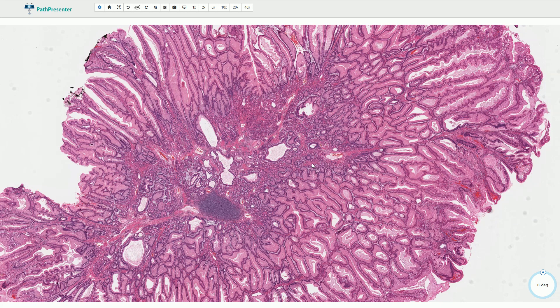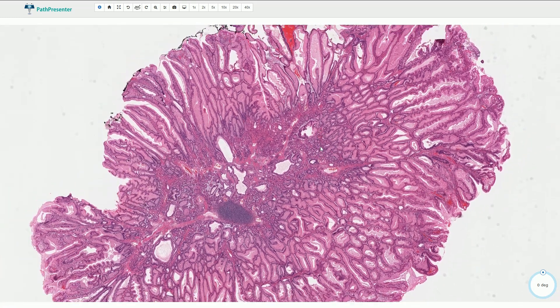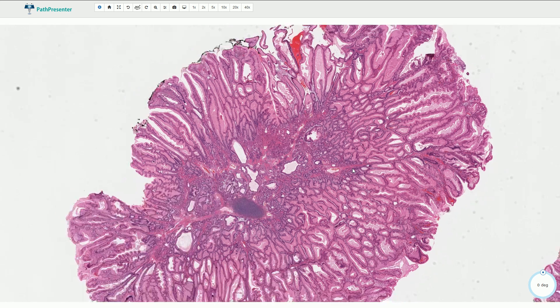They can occur in the colon, but the small intestine is also a quite common location, with the jejunum and ileum being the most common. Peutz-Jeghers polyps from the stomach are usually associated with a smooth muscle component that is slightly less prominent than in this case.